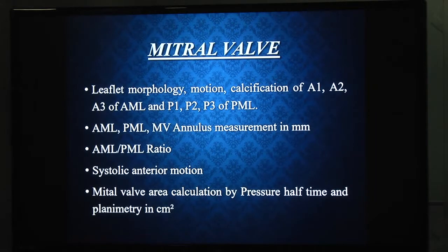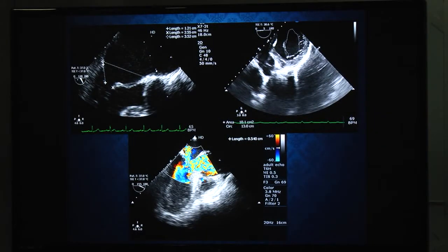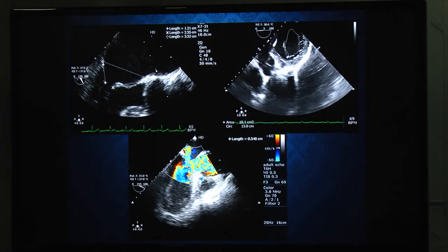For the mitral valve, assess leaflet morphology, motion, and calcification of all three components of each leaflet: A1, A2, A3 of the anterior mitral leaflet (AML) and P1, P2, P3 of the posterior mitral leaflet (PML). AML and PML lengths, AML-to-PML ratio, and systolic anterior motion of the mitral valve should be documented. Mitral valve area can be calculated by pressure half-time or planimetry. Mitral valve dimensions are better measured using zoom mode for accuracy, assessable in four-chamber and mid-esophageal long axis views. Planimetry is done in the transgastric basal short axis view (fish-mouth view), with the 2D plane positioned at the mitral tip level. Systolic anterior motion of the mitral valve can be seen in this view.